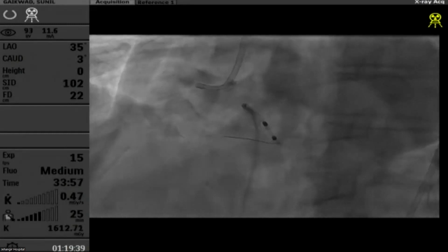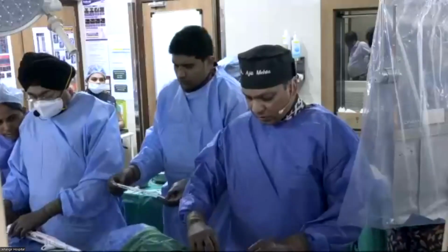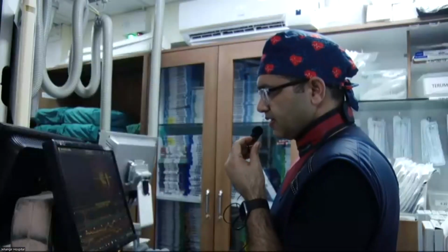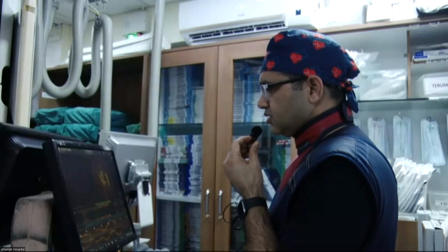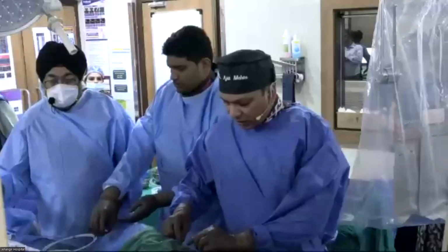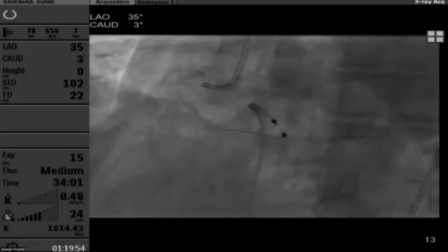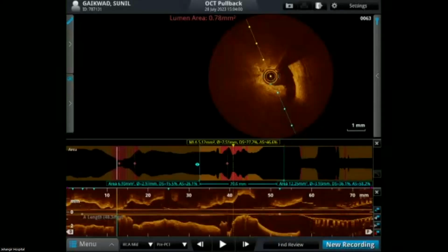So we're back and just checking in to see how things are going. Can you hear us? We can hear you, and we have 5 more minutes before we have to break off. We have done rotablator with 1.75 again, and now we're just going to do OCT again. Can you see the OCT image? Not yet. Now we can.